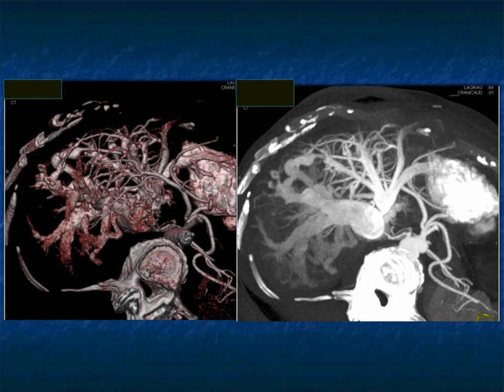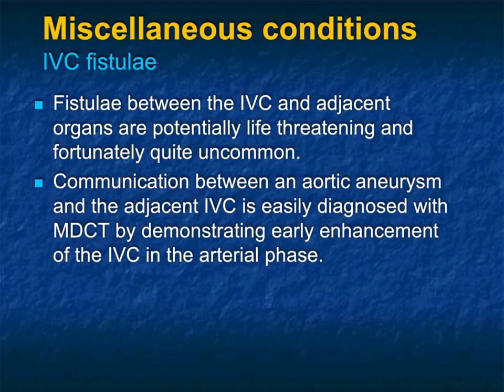And again, typically I see this in patients with poor right-sided heart function. If I don't scan the chest and I'm only scanning the abdomen and I see this, I'll suggest that the patient has right-sided heart failure, even though I'm not seeing the heart.